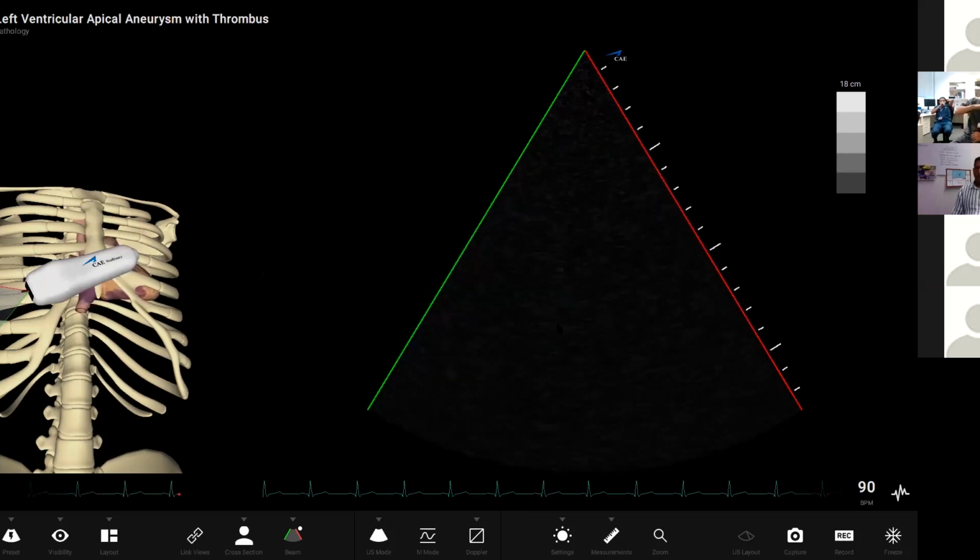So in the parasternal views, come down even to subcostal. In your short axis view, do your best, but get right next door to the sternum if you can. If you're looking for the ascending aorta, you can use that right sternal view, as Kylie was saying, or suprasternal views. For your apical views, go off axis if you have to, look for thrombus, and use your color Doppler to optimize the angle for the Doppler trace you're after. With all Doppler traces, make sure you optimize the picture so you've only got about 3 cardiac cycles, filling the screen, baseline towards the top of the image, and turn the gain down so you're after that modal velocity. But Doppler angle is essential, okay?